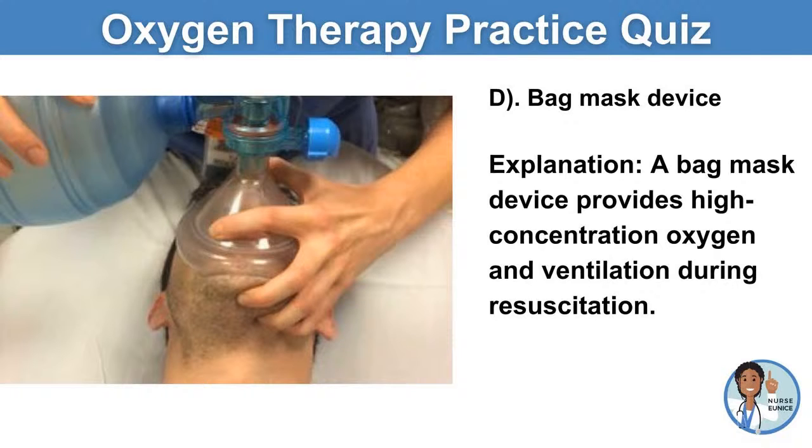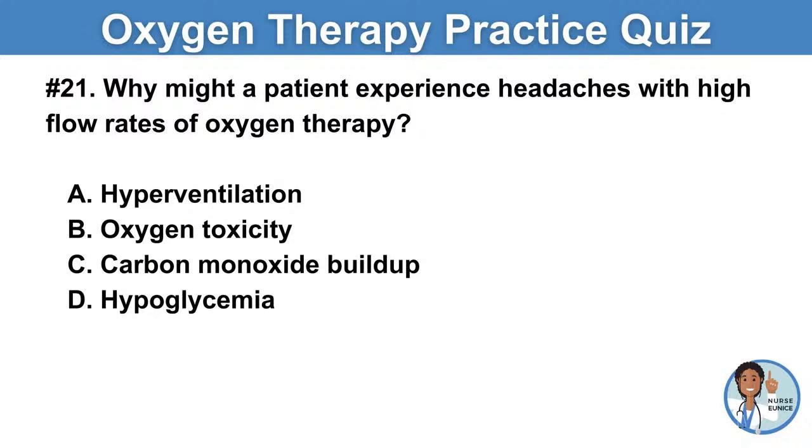When you look at the mask, her two fingers, her thumb and her pointing finger, are making the C, and her remaining fingers are making the E, and they're along the jawline. Open up the airway, and you'd administer your 2 breaths after the person receives their 30 chest compressions. So it's 30 compressions followed by 2 breaths.